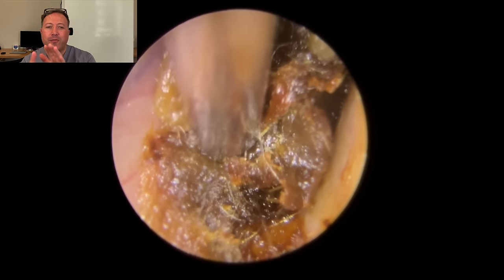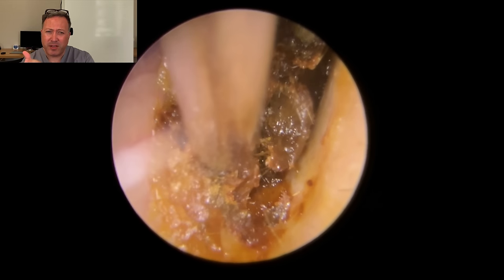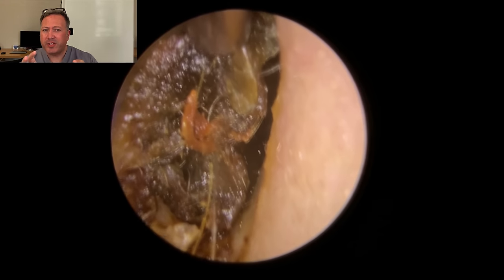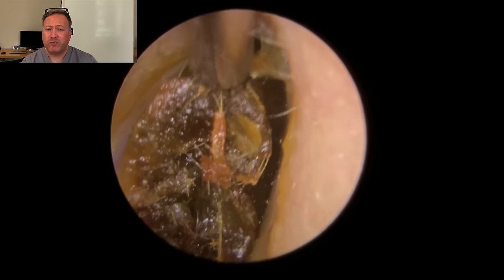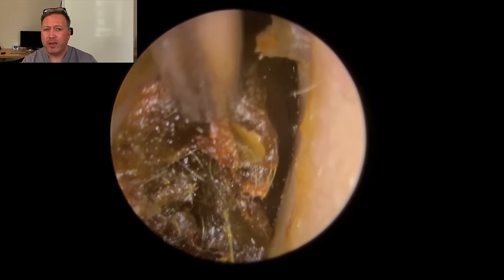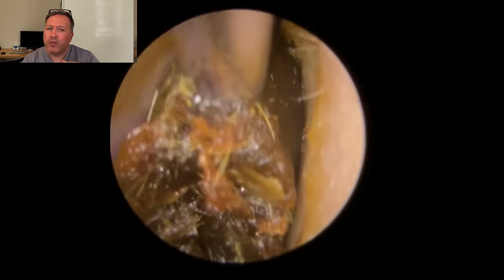So what you can see now, this patient's got some really soft and squishy wax there at the base of the canal with a harder section in the center, and a little bit of dry skin around the outside edge. So I'm just trying to use the suction tube to detach all those little bits of dry skin around the edge piece there, trying to find a good grip. There we are. And just rocking it ever so slightly just to fold the wax over.